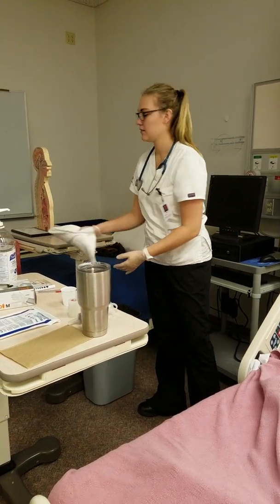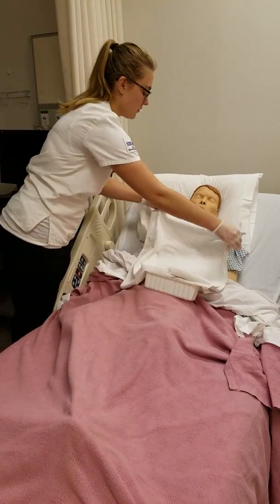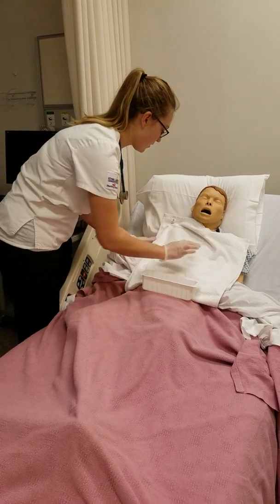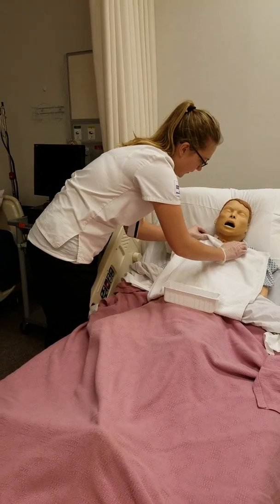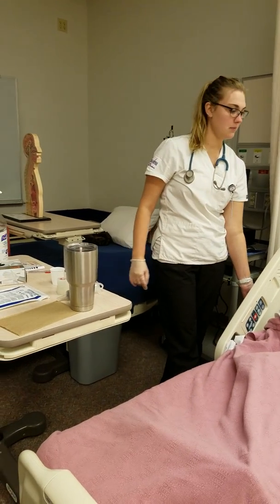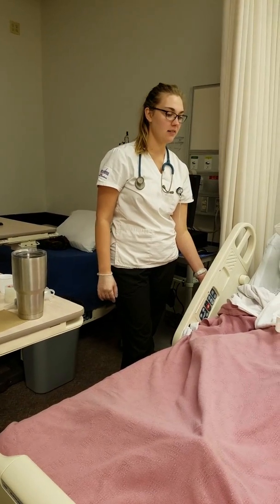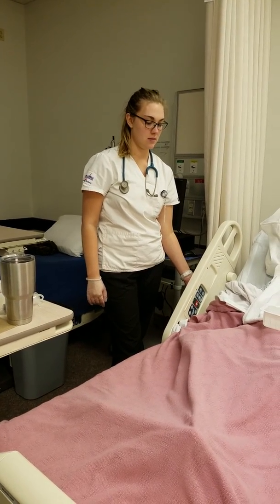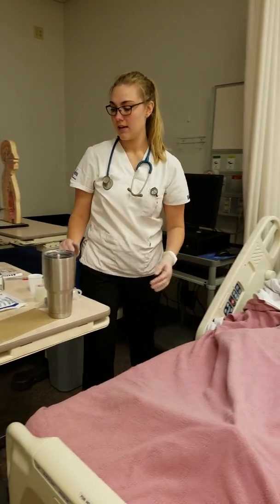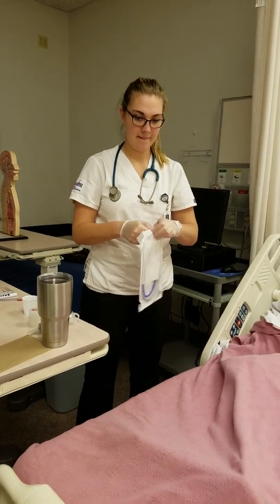Grab a towel and place this across your chest. Alright, are you ready to begin? So I'm going to raise the bed up. I'm going to make sure the head of the bed is at about a 45-degree angle. And now I'm going to open up my kit.